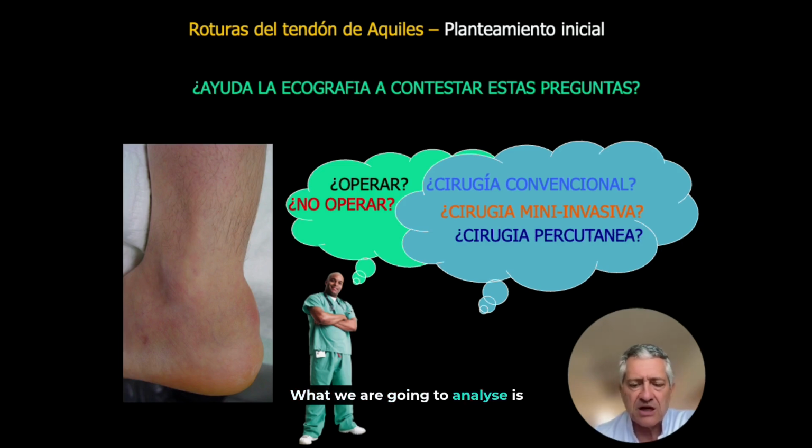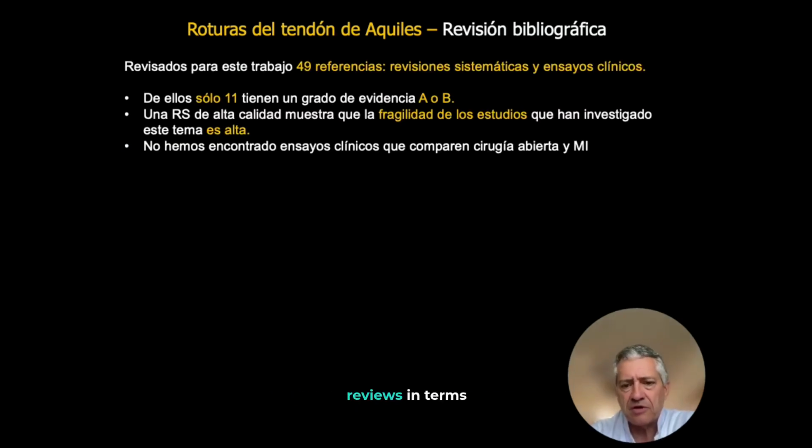What we are going to analyze is whether the ultrasound really provides us with information to answer these questions, and what science really contributes. The literature reviews regarding publications on this issue give the answers to these questions. For this work, we have reviewed 49 references, of which 11, including systematic reviews and clinical trials, had a relatively high level of evidence, A or B.